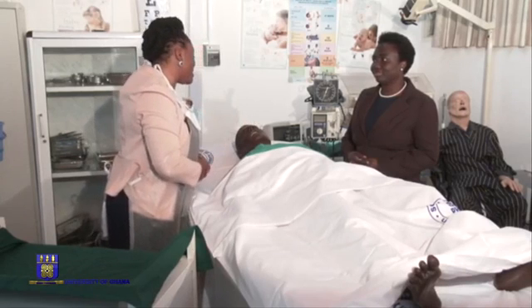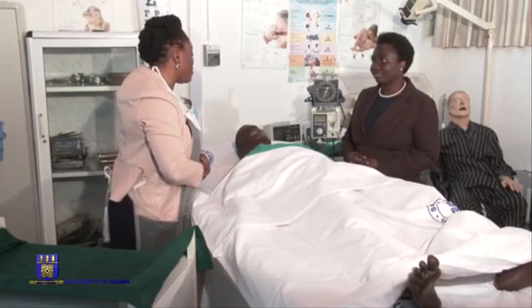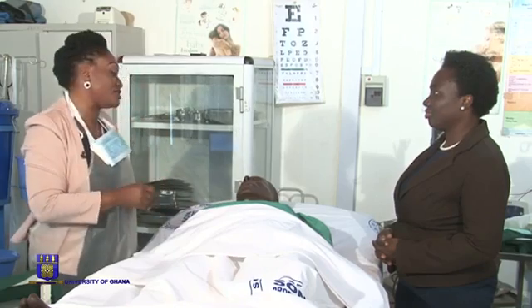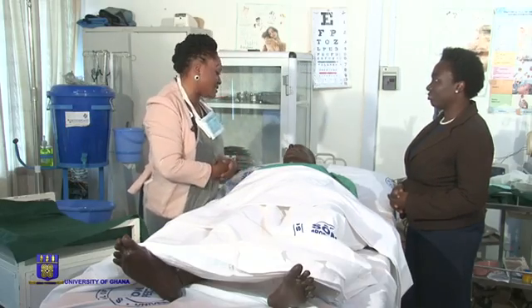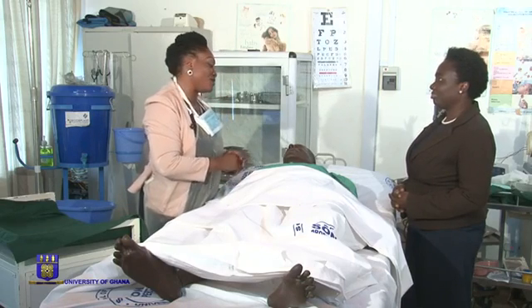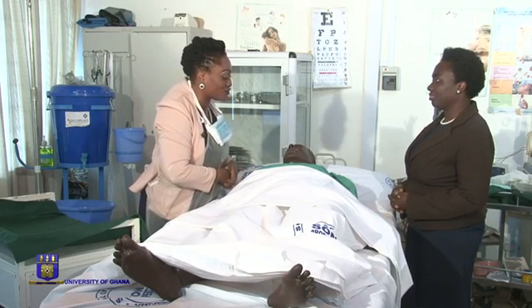She's Nurse Jancy, and she's here to assist me perform the wound dressing. And as we always do, we are going to use forceps, which are instruments that look like scissors. Don't be afraid, we are not going to hurt you. You will experience some discomfort, but the procedure will be over soon.